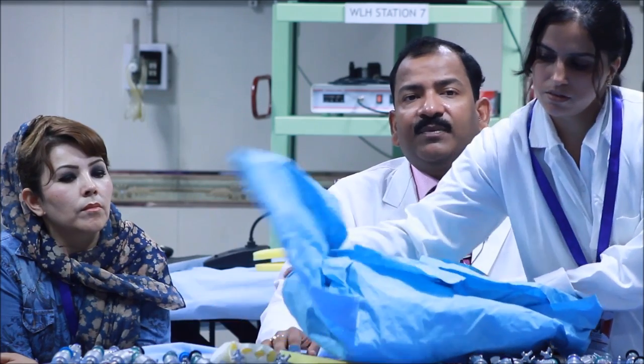75,000 means approximately $1,200, and that much cost every patient cannot afford. So you have to use the reusable instruments. If you are using them, then take care of proper sterilization. Sterilization and cleaning are both separately important. Cleaning is also important. I will show you later how to clean, once I come to the instruments.